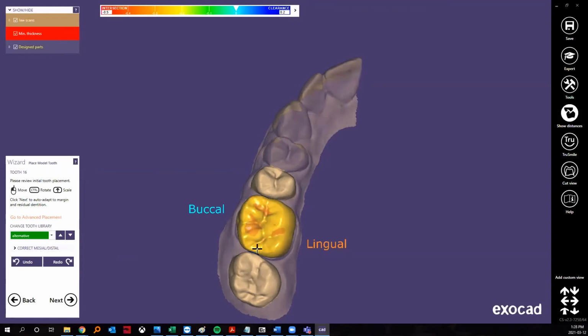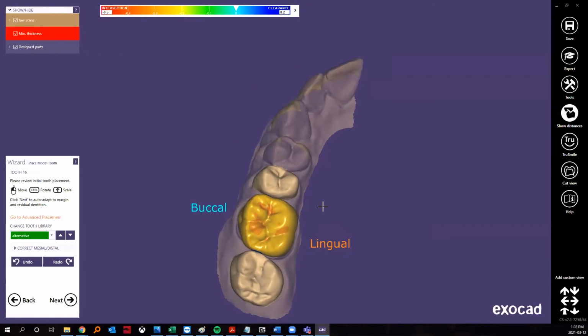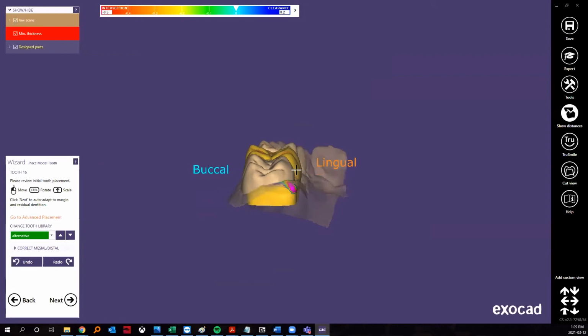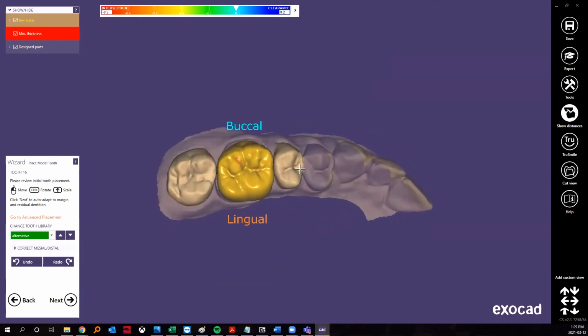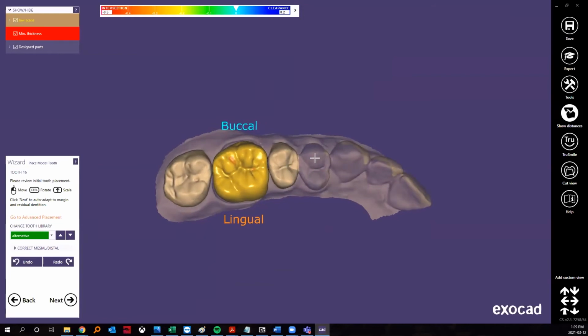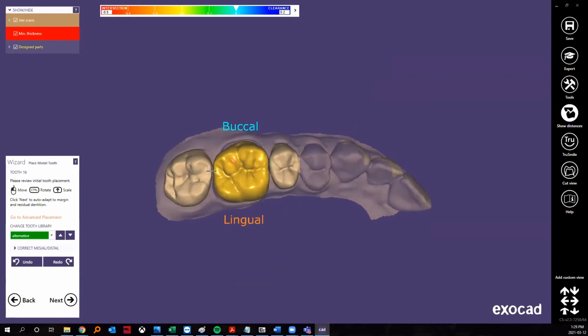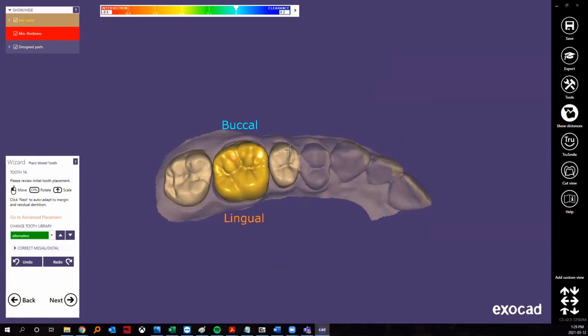Now, I haven't set the tooth in any way, shape, or form in relation to my natural dentition or my surrounding dentition, but I want to point out that we can see the red here. That's the minimum thickness kind of shining through. So here, I always recommend not spending too much time. You're just kind of giving it general positioning. And this is actually a great case. It's not perfect. You can see this tooth is kind of rotated. So we're gonna have a very small contact point here, and we'll only be able to do a small contact point here. So kind of real life.